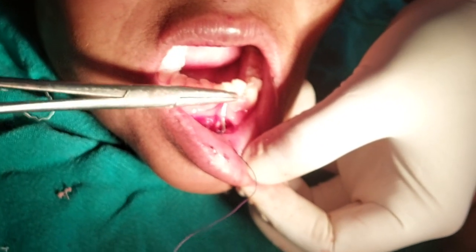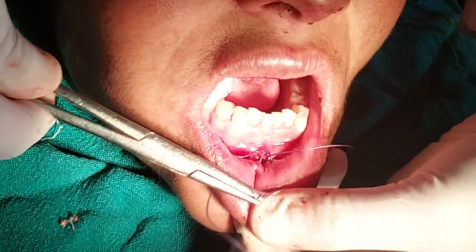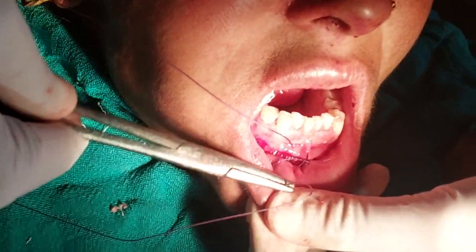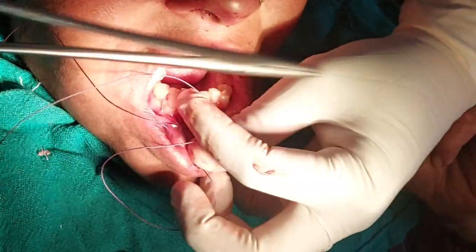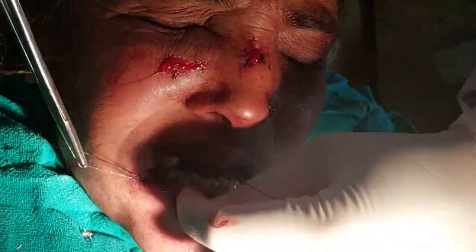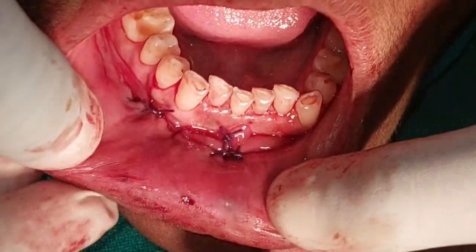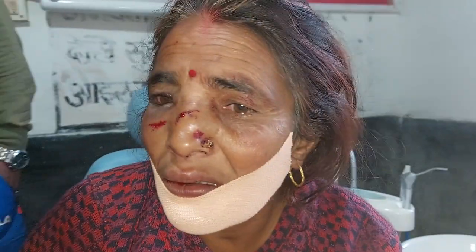The superficial layer was sutured using a continuous interlocking method. Principles of suturing were followed to ensure good approximation of tissues and allow rapid healing. Any gap that was seen later was closed using a simple suture.